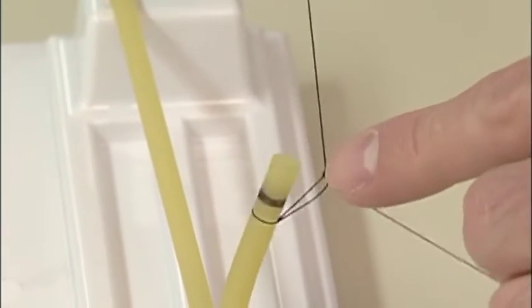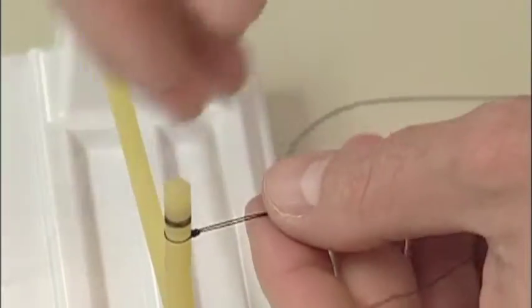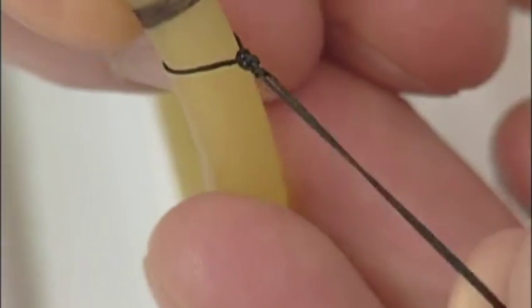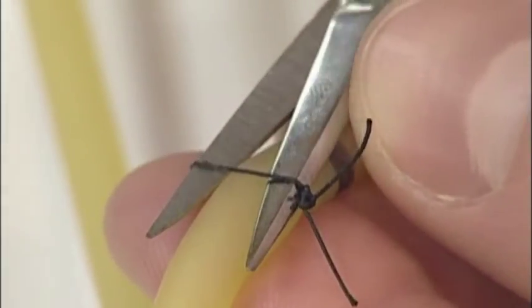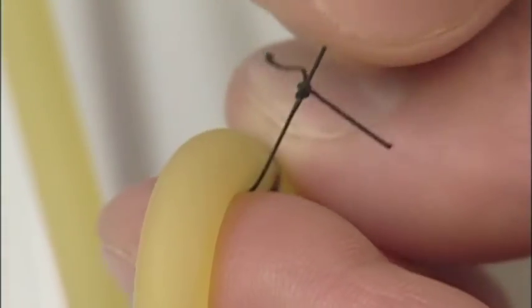Also, if you don't tie these second and third throws down square or snug down your knots appropriately, you will wind up having an insecure knot as a result, and or a gap error, as can be seen in this stitch. We'll cut our tails to even lengths and then slide these scissors in below the ligature, and you can see that that one slides quite a bit, and that would be an insecure knot with slippage.